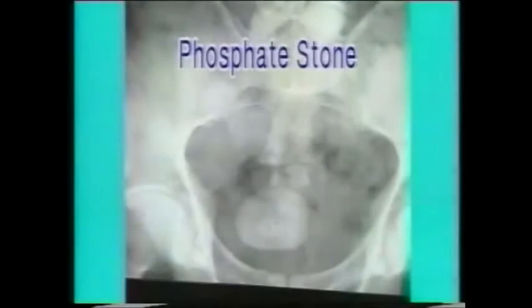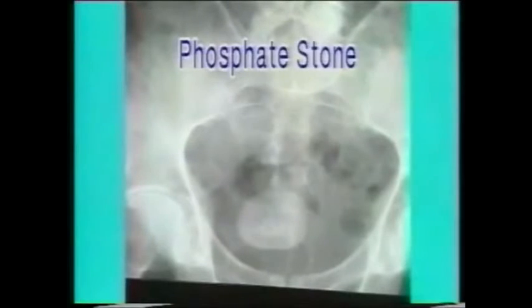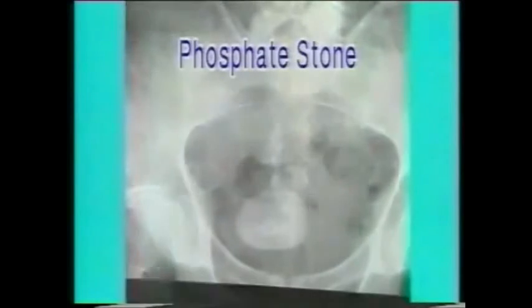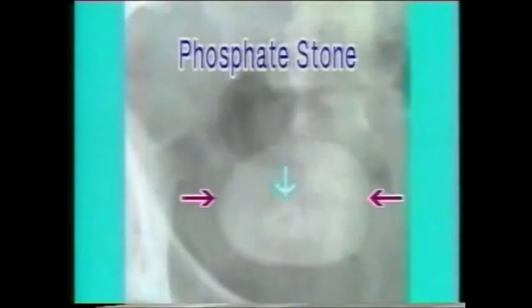This is a phosphate stone. Note the typical smooth and lamellated appearance of phosphate stones. They form in infected urine and are deposited layer by layer, hence they have a lamellated appearance.